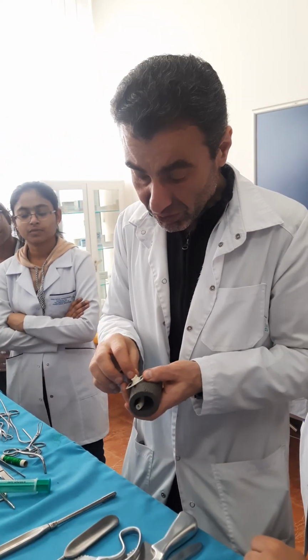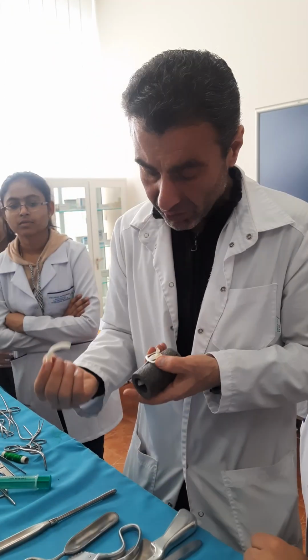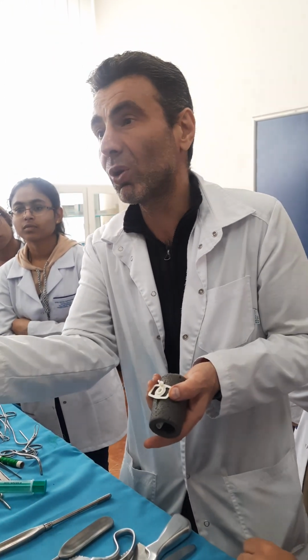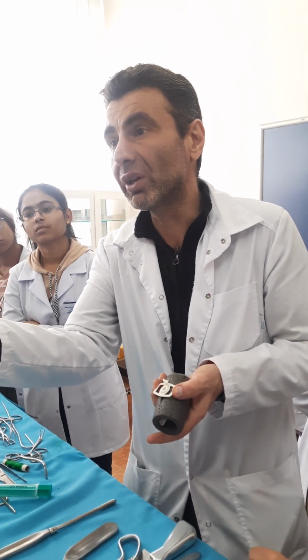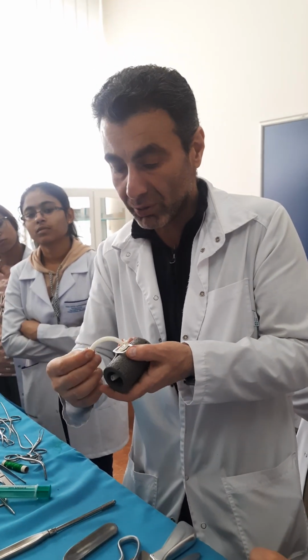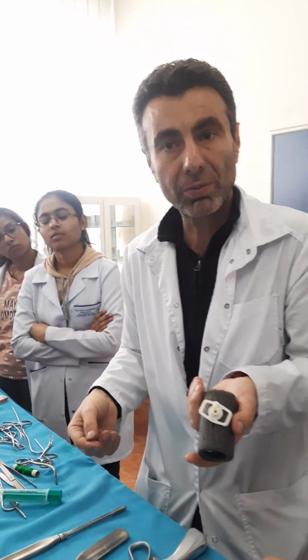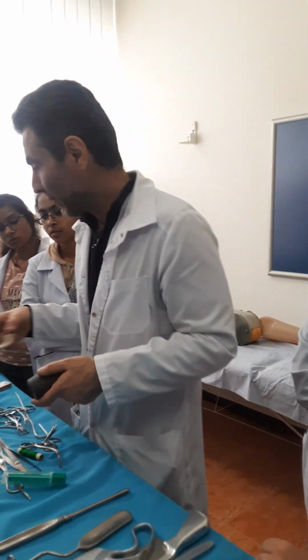Now about the instrument. The instrument has 2 parts. Look, inner tube, outer tube, and the lock. Why is it necessary? You will clean, you will wash. Slime will close it. And to not remove the whole instrument, you will remove only the inner tube, you will wash it, and then again you will put it in its place and fix it.